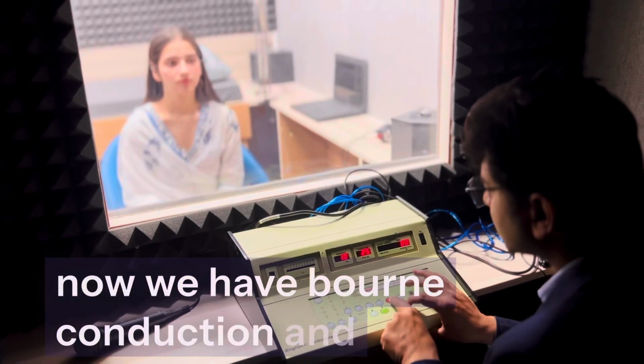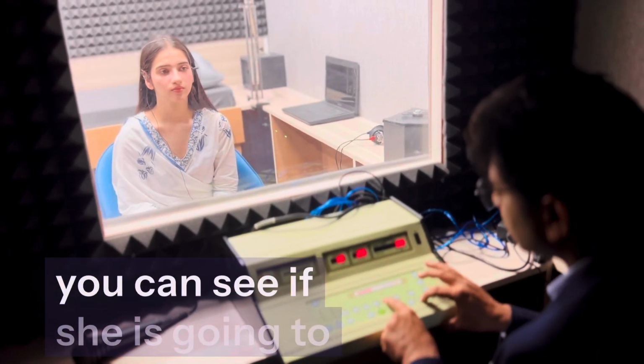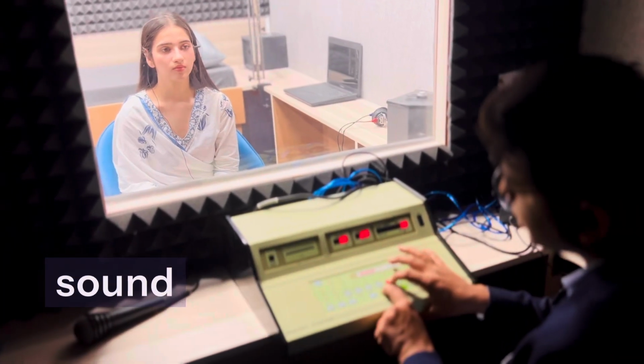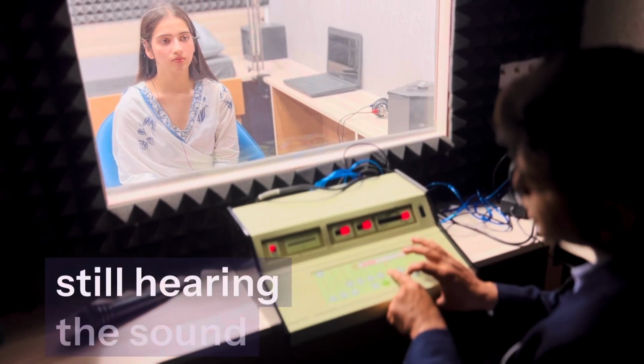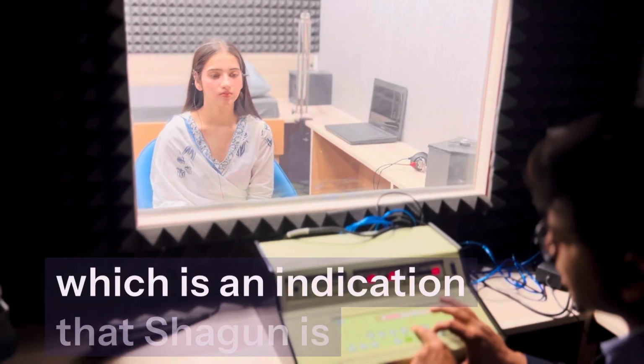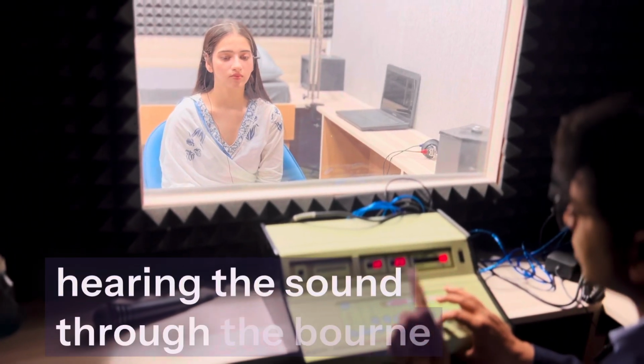Now we have bone conduction, and you can see if she is going to respond. You can see she is responding whenever she is hearing the sound. I've reduced the volume and she is still hearing the sound, which is an indication that Shagun is hearing the sound through the bone conduction.